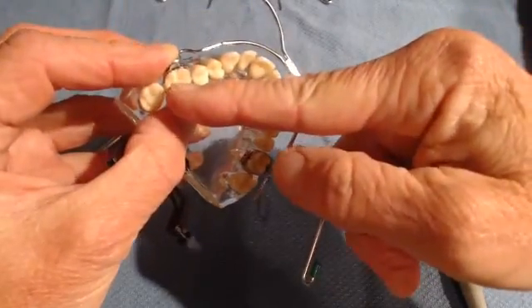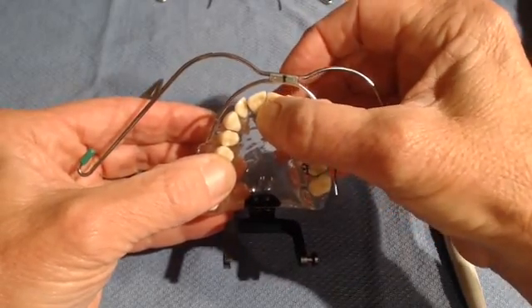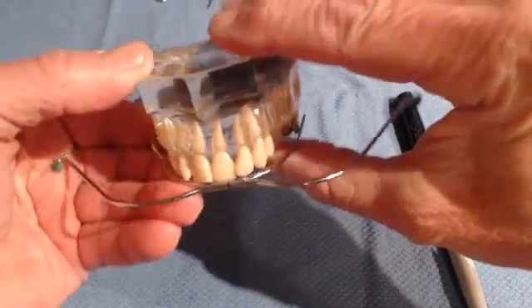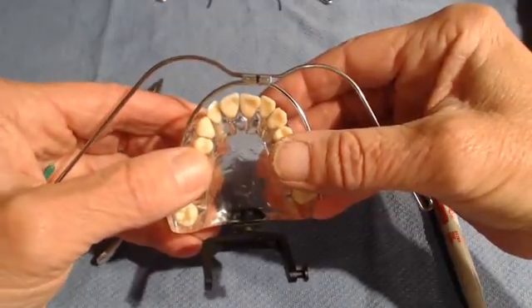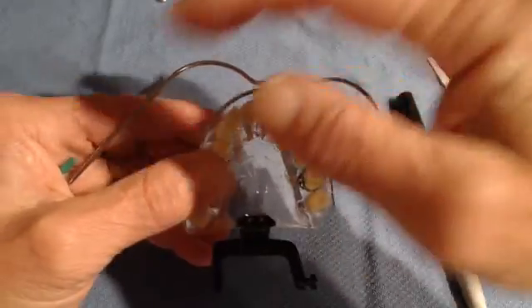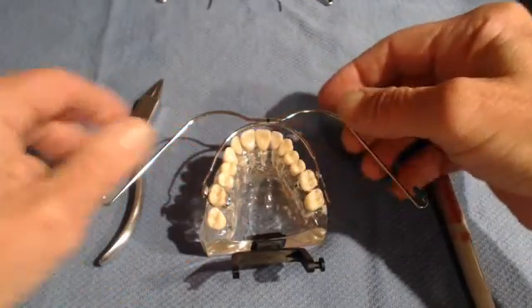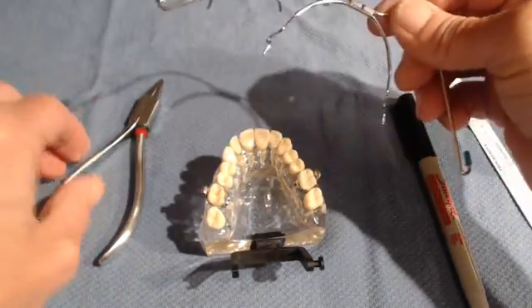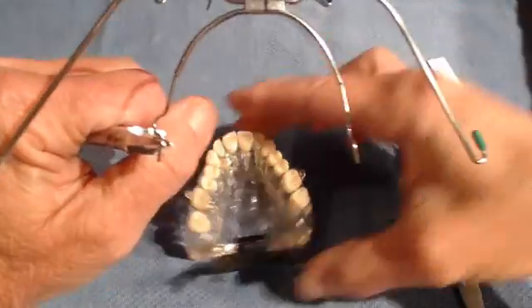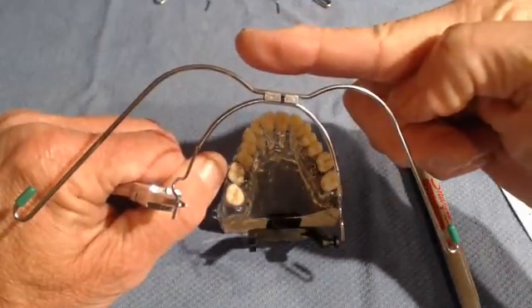Insert one side only. Notice how one side is not inserted and one side is. Then carefully observe where the midline mark falls on the middle of the patient — you can do this on the superior aspect clinically. I can see the midline mark needs to move to my left. An easy way to remember this: remove the face bow, put the light wire plier on the straight wire section just distal to the U-loop so you don't distort the tube, and push the midline to the left.